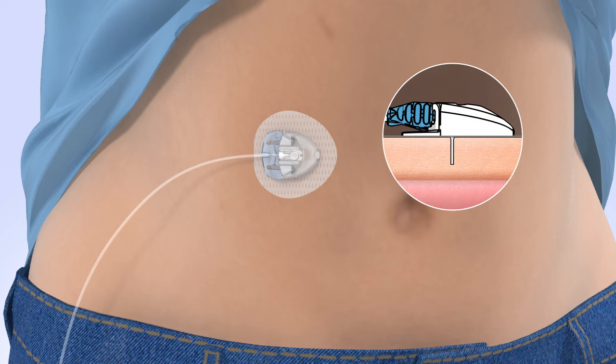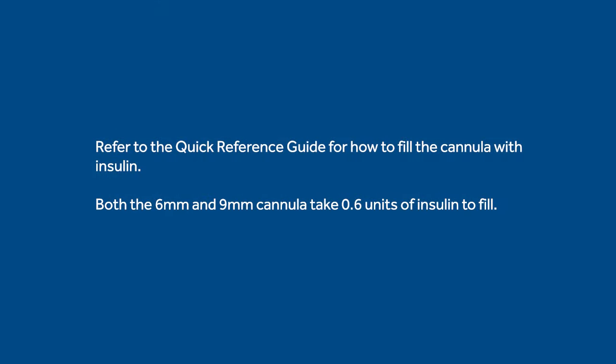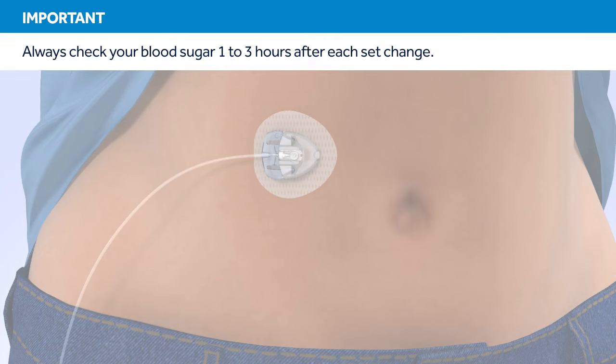Now that the introducer needle is removed, the cannula is empty and will need to be filled with insulin. Using the pump, fill the cannula with insulin. Both the 6mm and 9mm cannula take 0.6 units of insulin to fill. Remember, 1-3 hours after inserting a new set, you should check your blood glucose. Checking your blood glucose is the only way to confirm your infusion set is properly inserted and that you're receiving insulin.